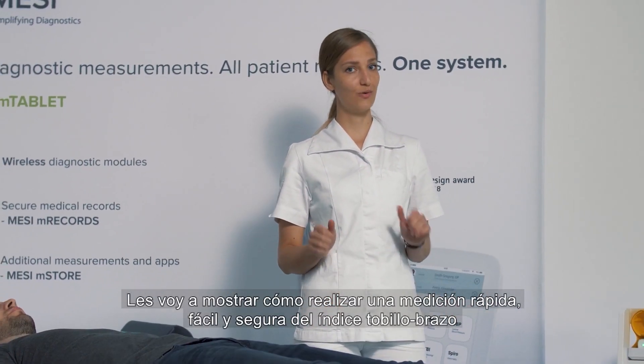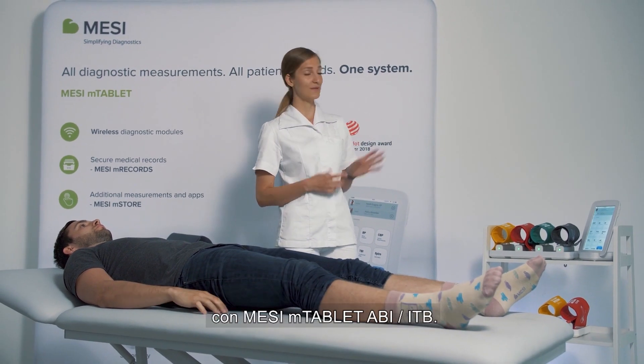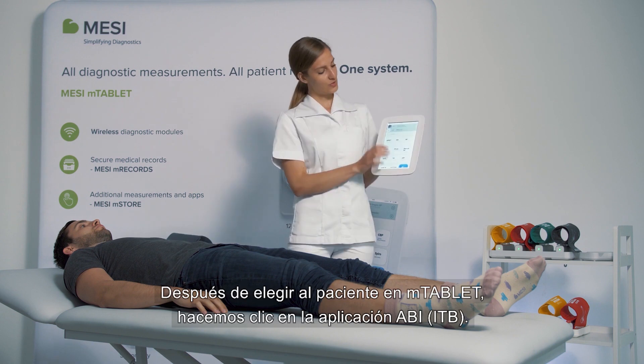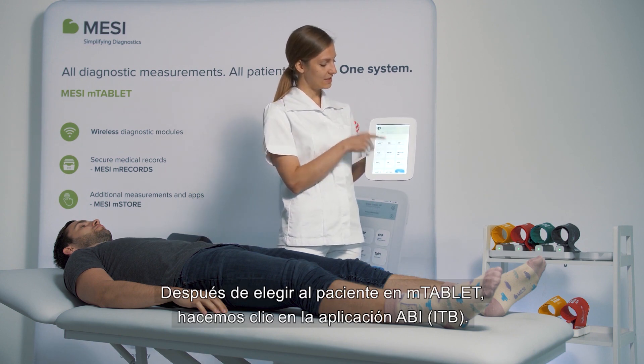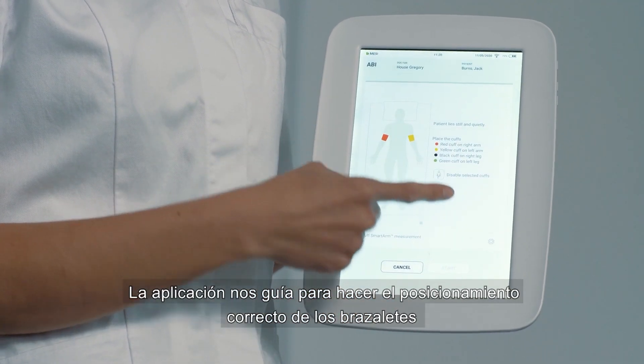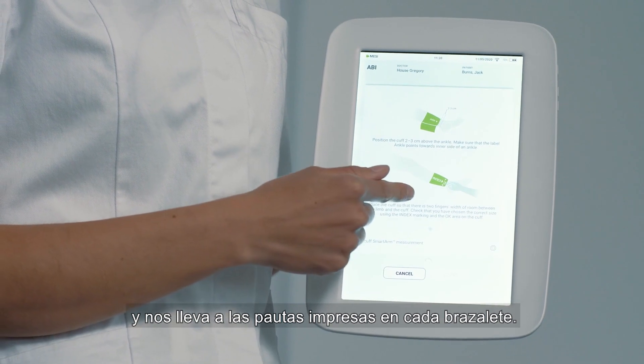I will show you how to perform a quick, easy and reliable measurement of ankle brachial index with MISSI M-Tablet ABI. After choosing your patient on the M-Tablet, you choose the ABI application. The application guides you through the correct cuff placement and directs you to the guidelines printed on each cuff.